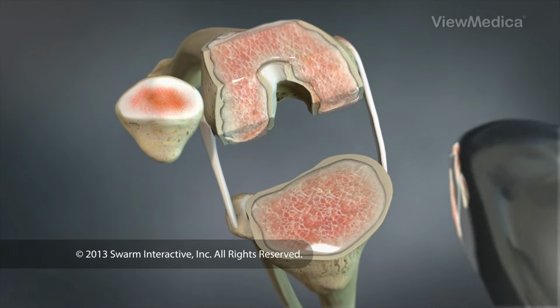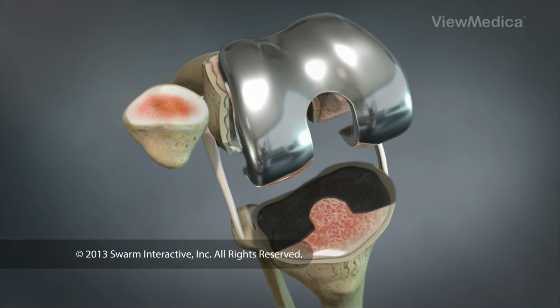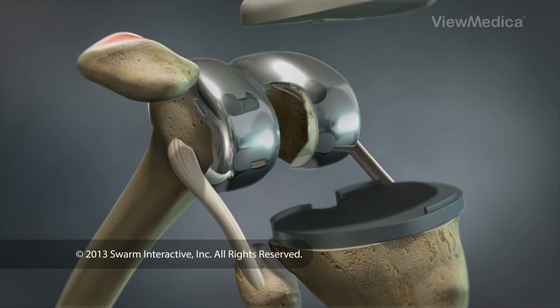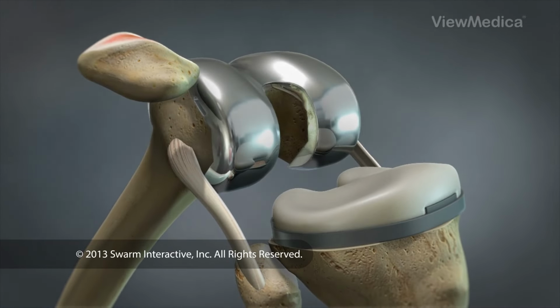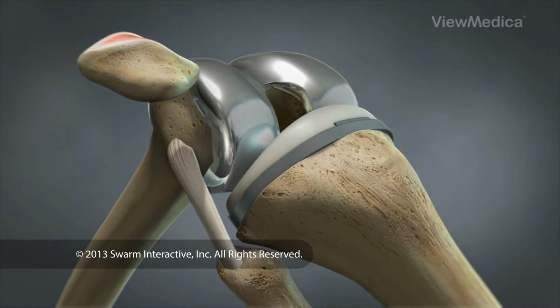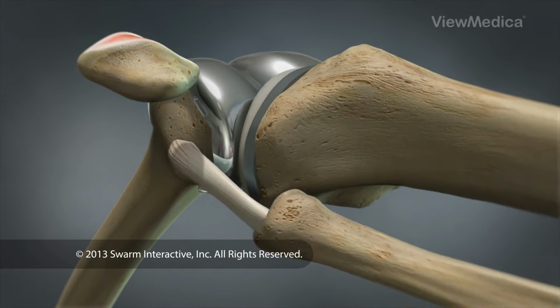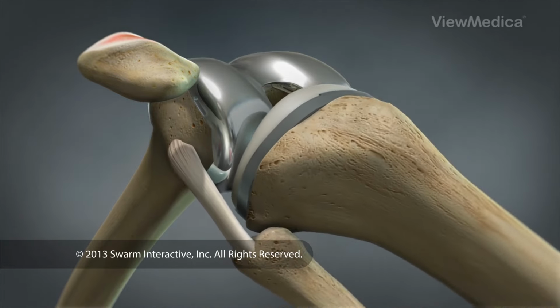The surgeon inserts the metal femoral and tibial components. The surgeon secures a plastic spacer onto the tibia component. The spacer will allow the femoral component to glide smoothly and naturally as the knee is used.